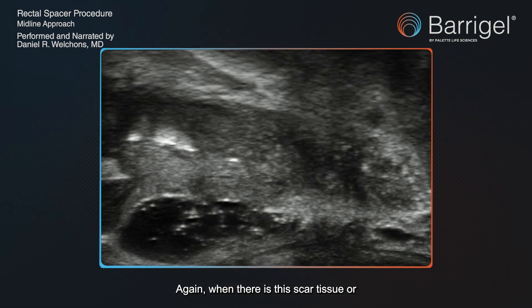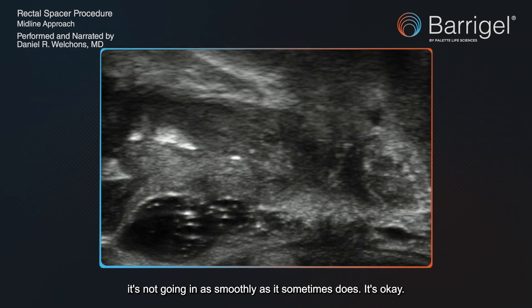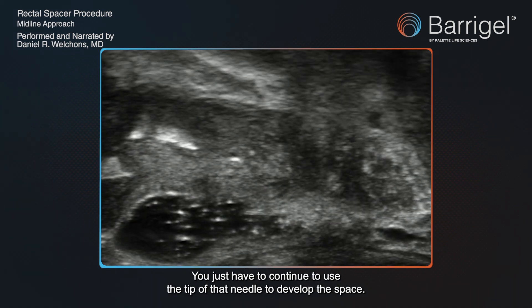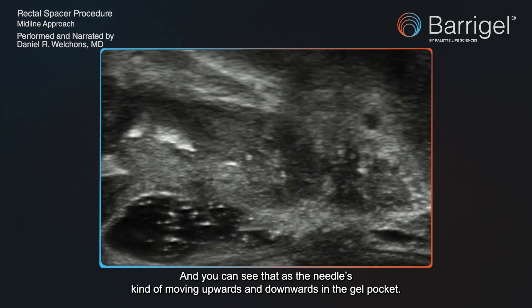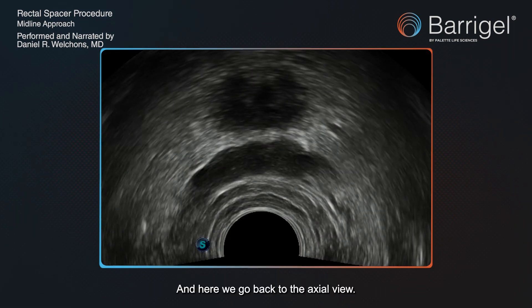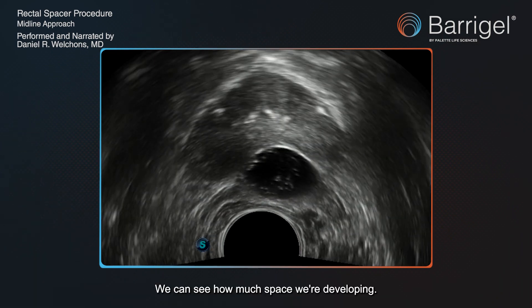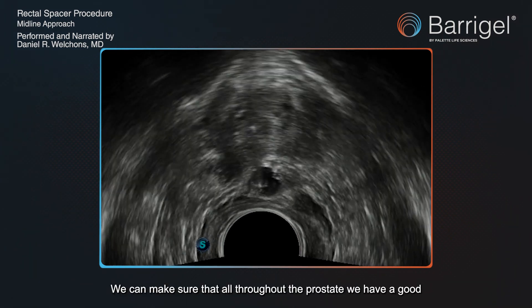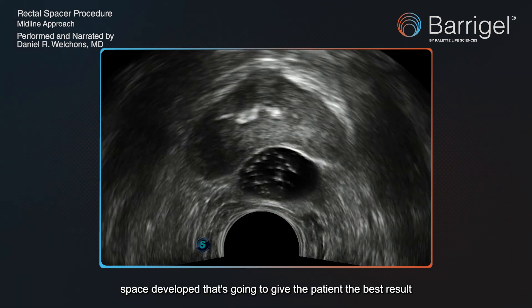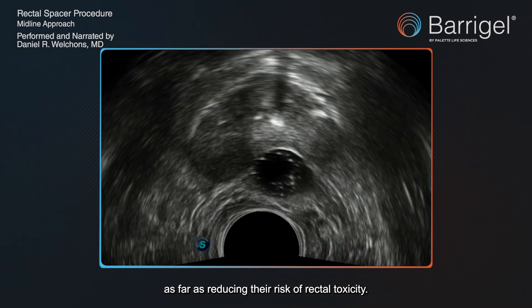When there is scar tissue and it's not going in as smoothly as it sometimes does, that's okay. You just have to continue to use the tip of that needle to develop the space. You can see the needle moving upwards and downwards in the gel pocket. Going back to the axial view, we can see exactly how much symmetry we have, how much space we're developing, and make sure that all throughout the prostate we have a good space that's going to give the patient the best result in reducing their risk of rectal toxicity.